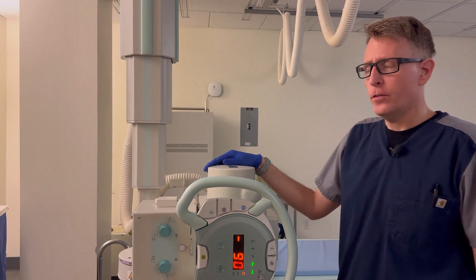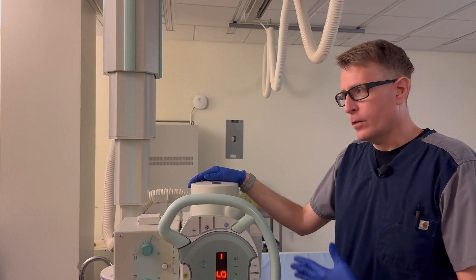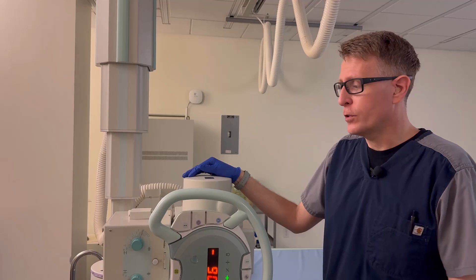The next thing we're going to do is a sinus series, four views. All of them can be done at a 72-inch SID. Some sites are going to say you have to do them at 40, but there's no reason that you could not use 72 for all four exposures.